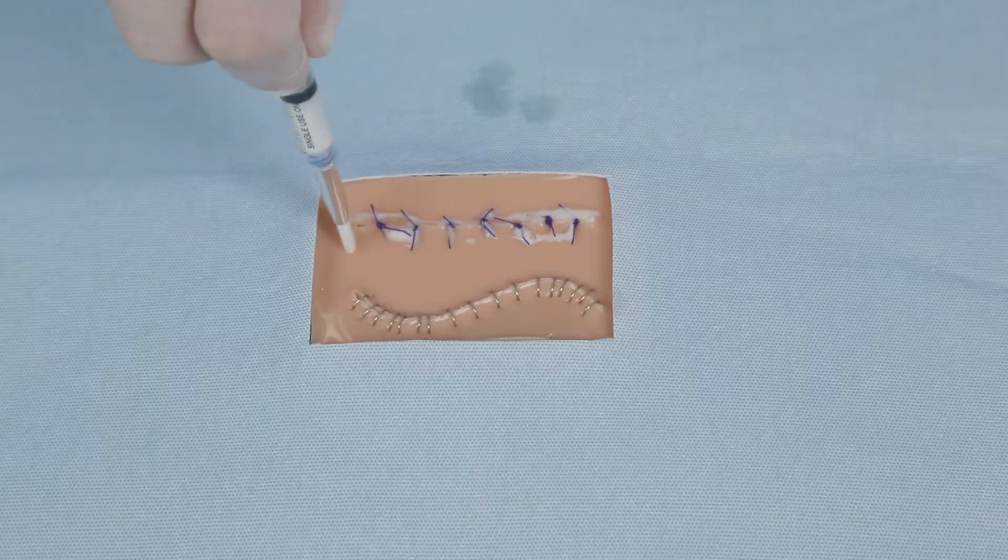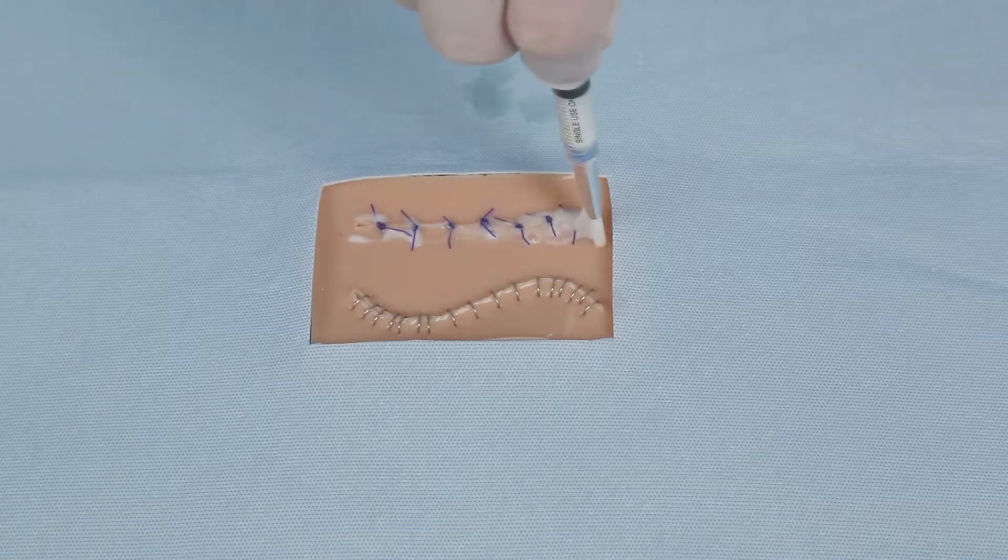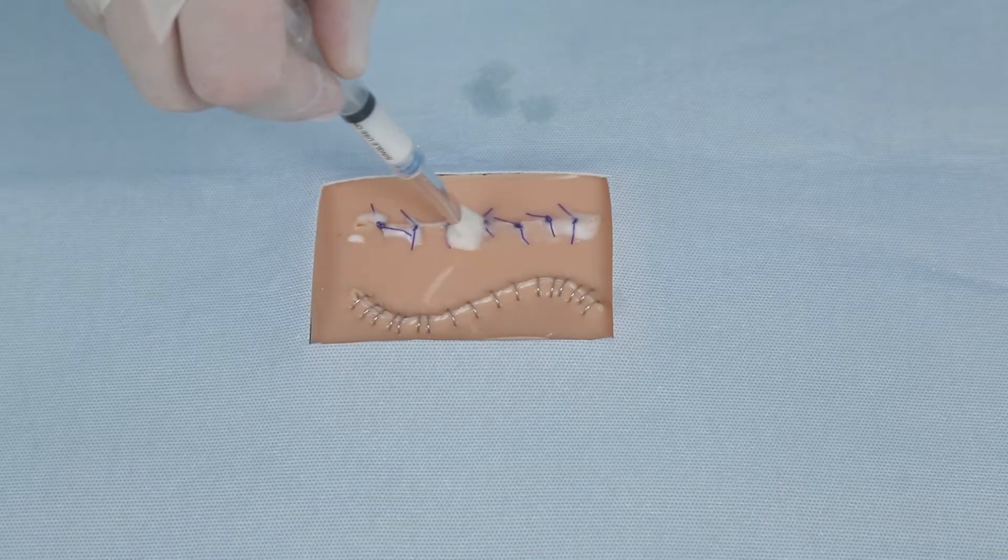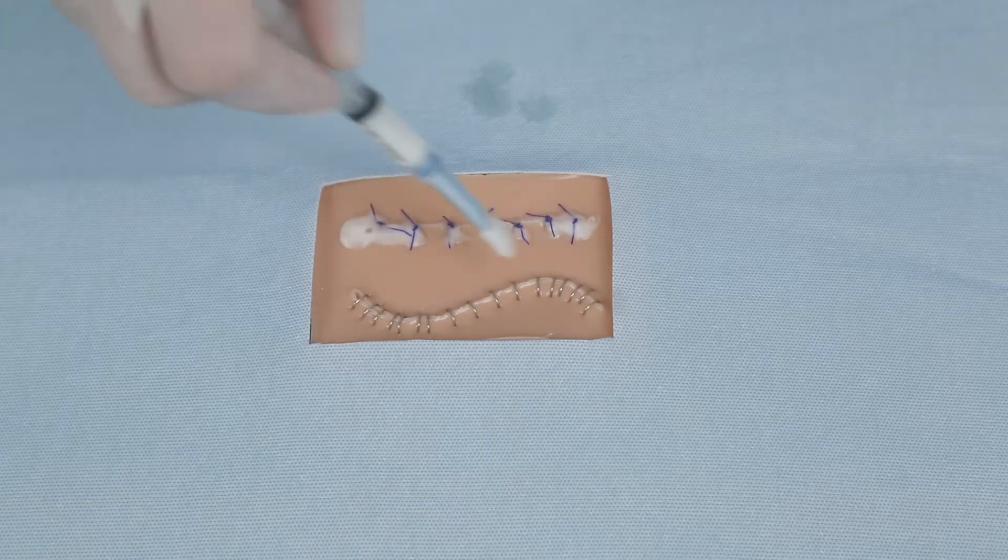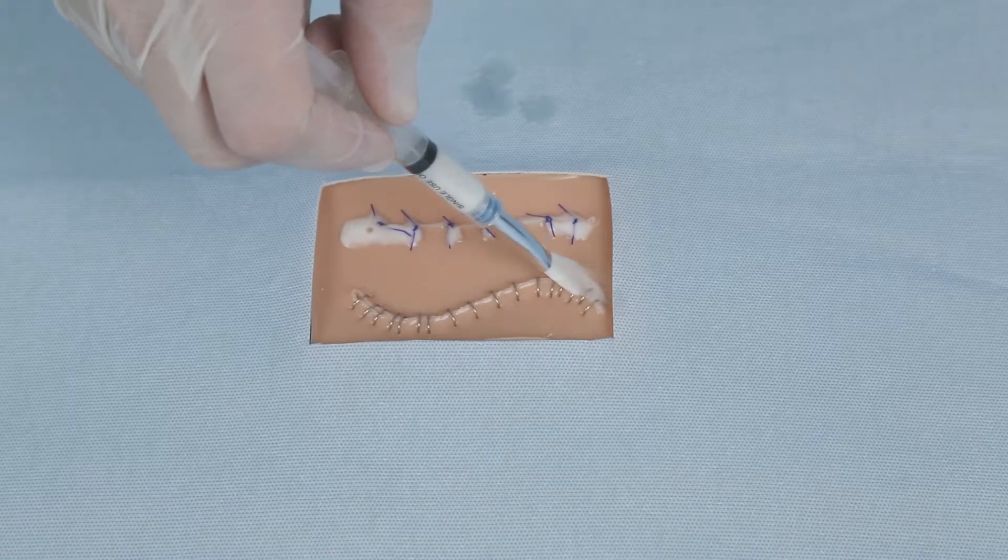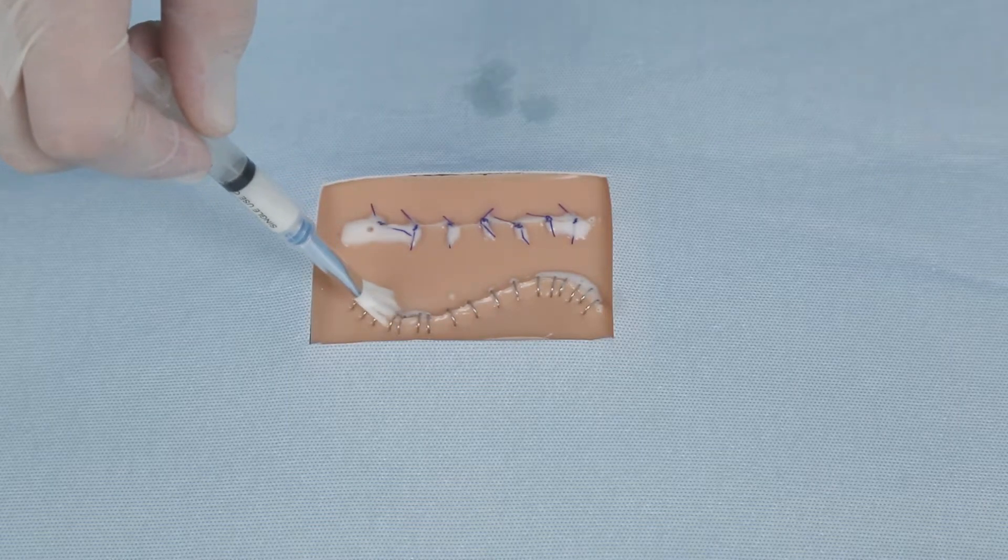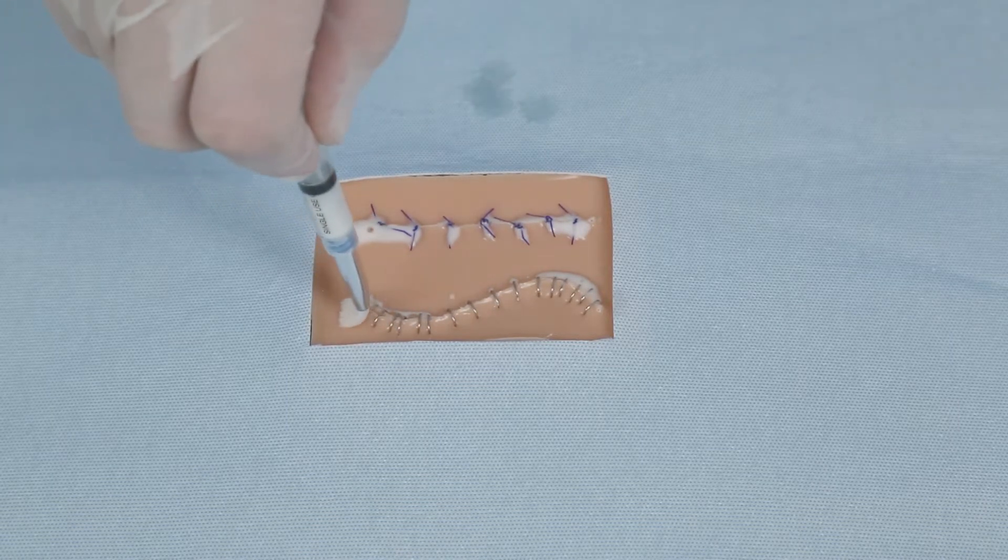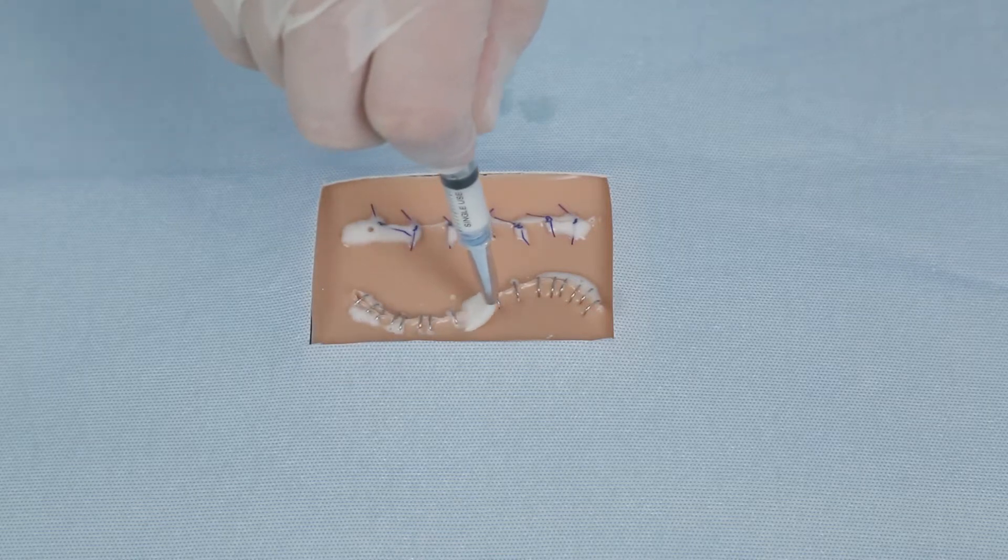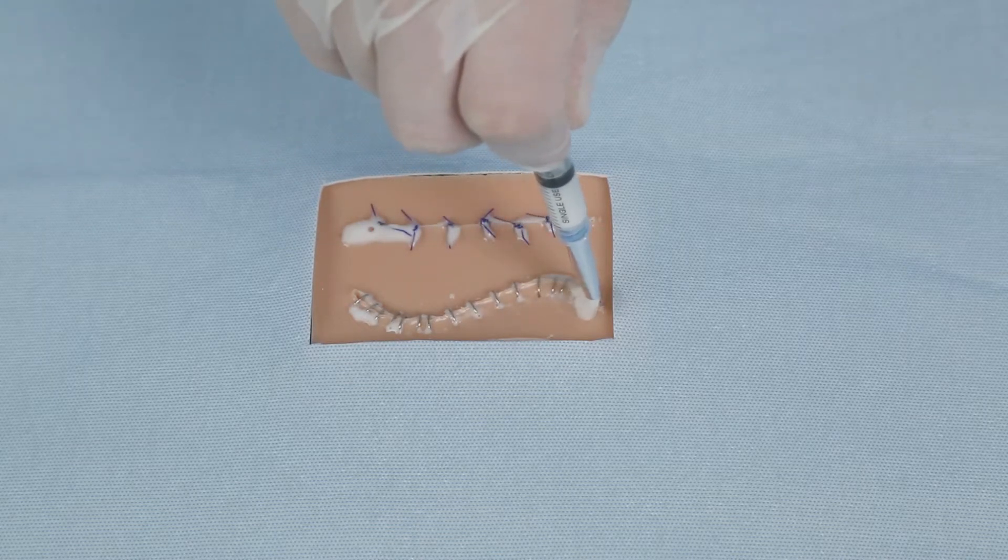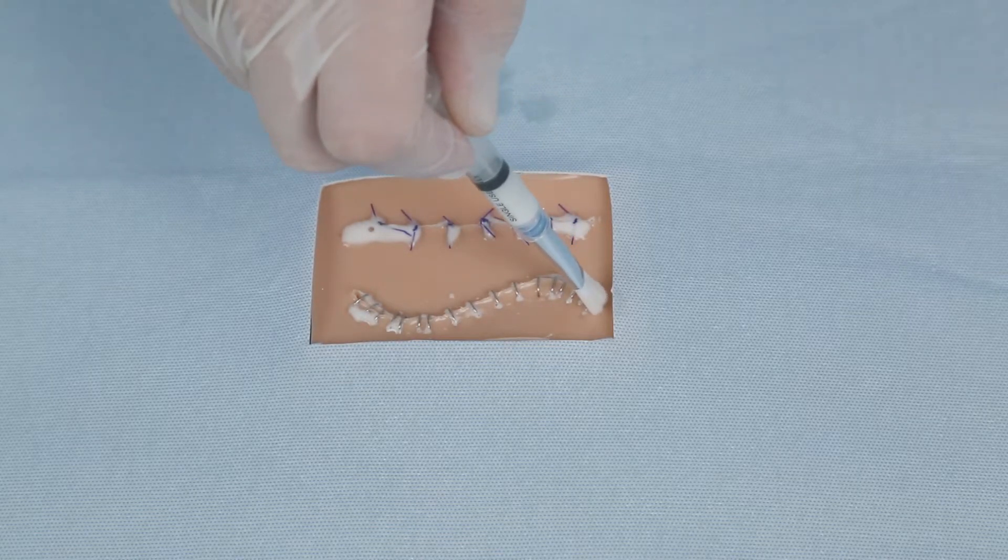Slowly push the syringe plunger until the Suture Seal polymer begins to dispense from the brush tip. Brush the Suture Seal polymer over the suture line or wound area in a thin even layer. Suture Seal is sometimes difficult to see because it is transparent or a milky white color. Runoff of excess liquid is expected. Within two minutes the Suture Seal polymer will become an adherent gel.